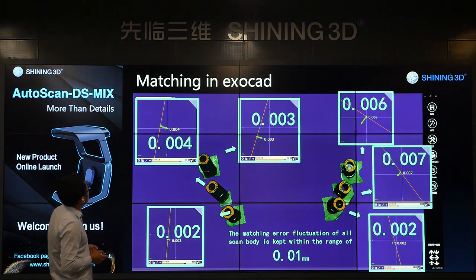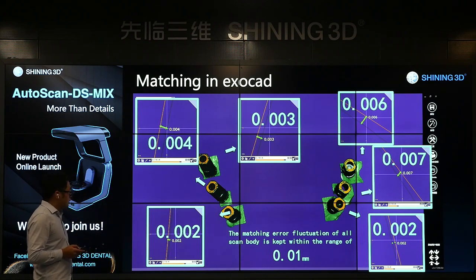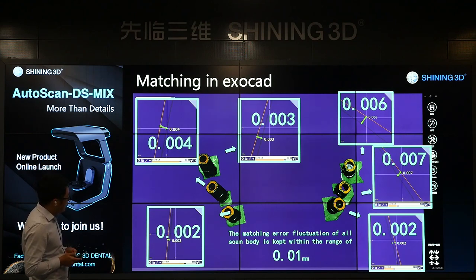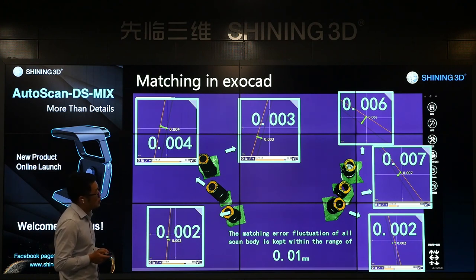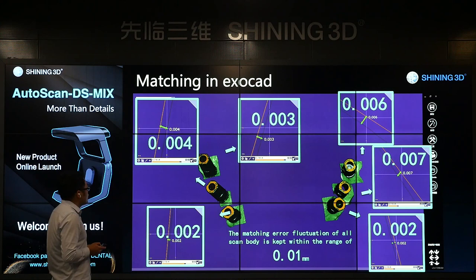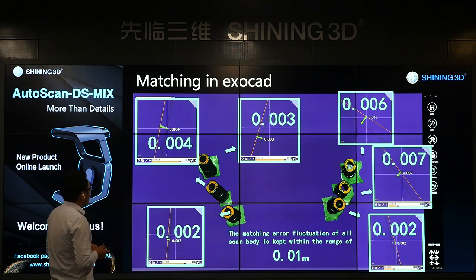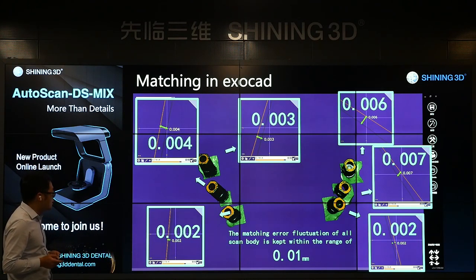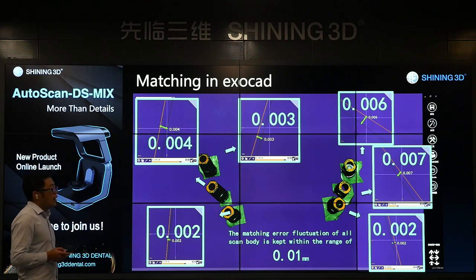After scanning, we can check the merging effect. So choose position number 4. Let's check the figure. 0.002. Choose position 5, 0.004 millimeter, 0.007 millimeter. And choose position 6, 0.003 millimeter, another side 0.006 millimeter. So all the margin error fluctuation of all the scanbodies is less than 0.01 millimeter. So this figure is excellent.